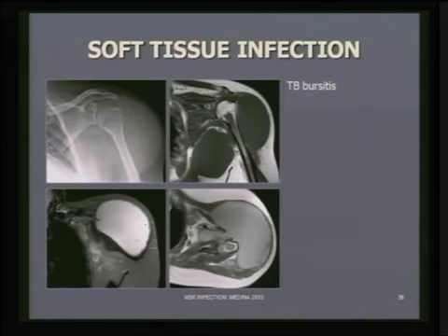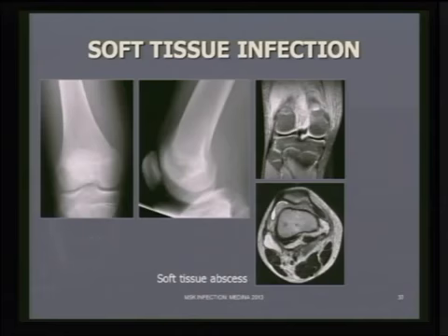But sometimes we don't see the sort of inflammatory nature of the lesion. This is a middle-aged lady presenting with a massively swollen shoulder and a huge, what turned out to be, subdeltoid subacromial bursitis with rice body formation. And in this situation, really, there's two diagnoses we think of. Again, in the Asian population, this turned out to be a case of tuberculous bursitis. And again, note here the multiple axillary lymph nodes, which we would not expect to see in a soft tissue sarcoma. And the other condition, of course, is a first presentation of chronic rheumatoid disease.